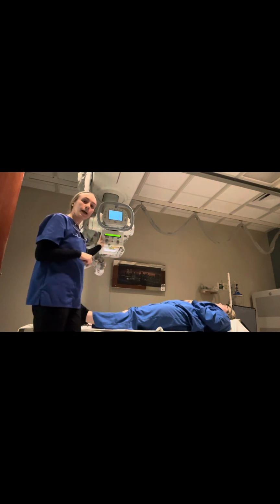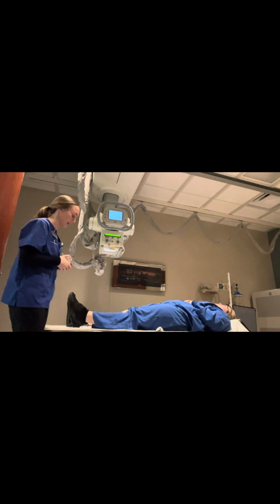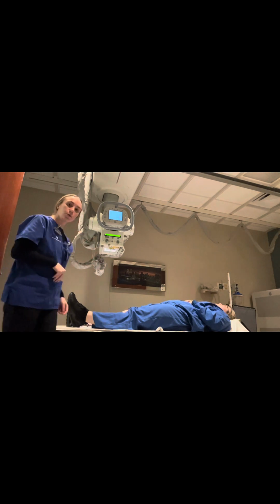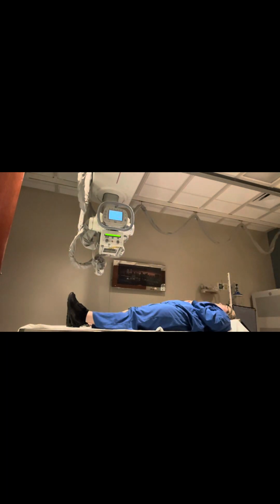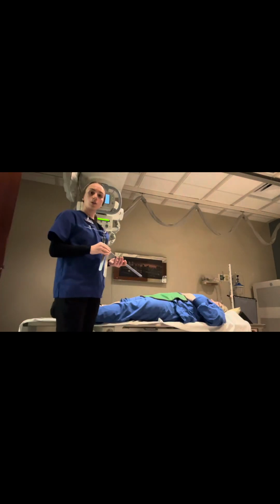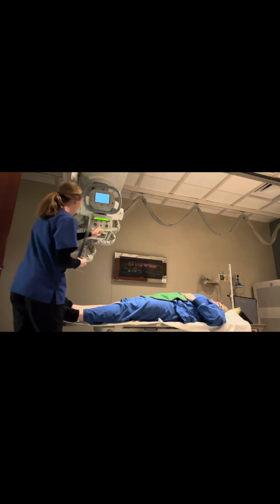And then once your alignment and centering is all lined up, you're going to put a left marker on the lateral aspect. And then lastly, before exposing, I'm going to throw a shield over her gonad region just to ensure radiation protection. I'm going to lay this on you, okay? We also need to measure the part so we can set the appropriate exposure factors based on the width of her lower leg. So I'm going to do that now.